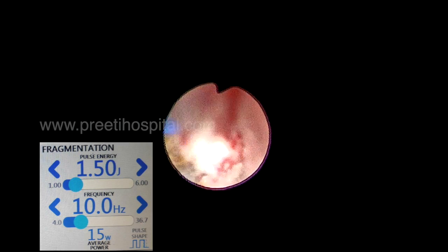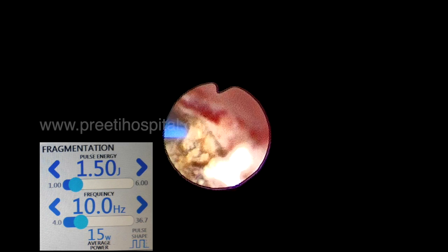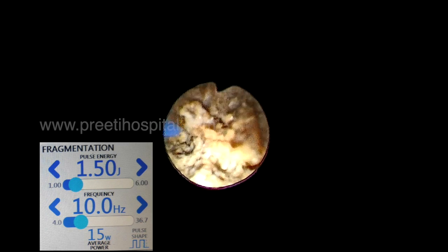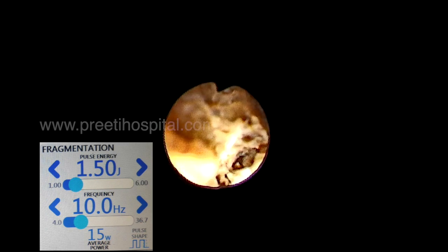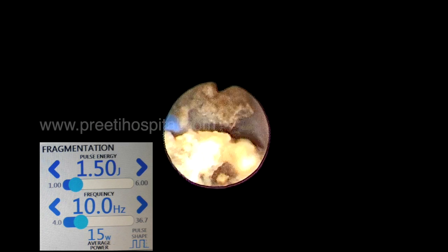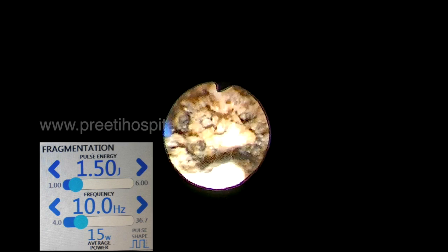After initial space is created in the pelvis, we can groove the stone in one place continuously so that it becomes weakened and breaks exactly in the middle. You are grooving with the laser fiber and it becomes two pieces.